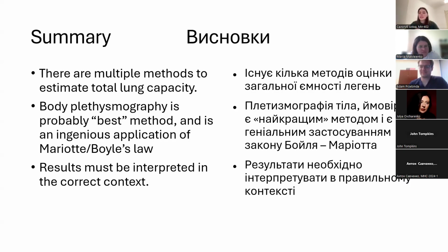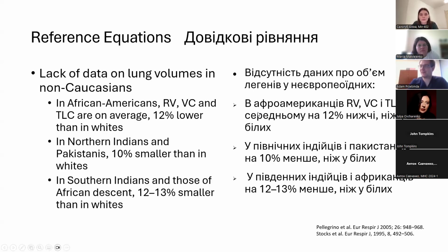Thank you. I wanted to ask about patients. Is there a minimum or maximum age at which you can perform plethysmography? No, you can perform it at any age. Plethysmography is not very difficult compared to spirometry. The problem that happens at very old age is that the normal graphs are difficult to generate.